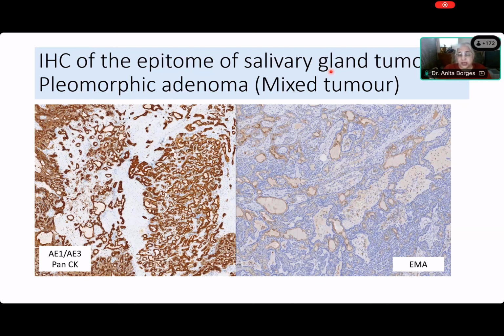Okay. Now you'll see the S100 protein. What does the S100 protein show you, Madhu? Luminal cell positivity. Sorry, what is it showing you, Madhu? Ma'am, there is basal cell positivity. Basal cell positivity.